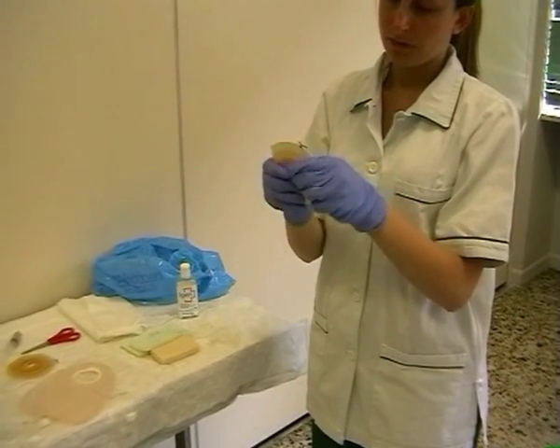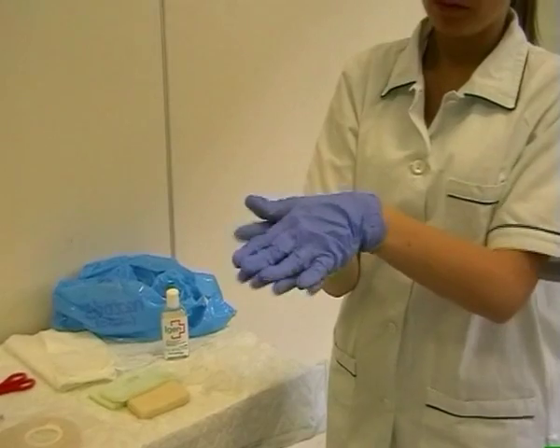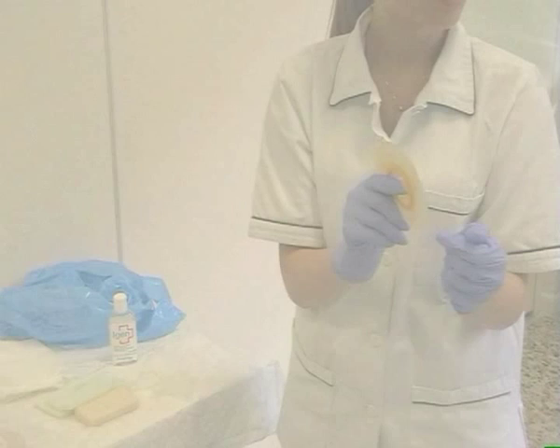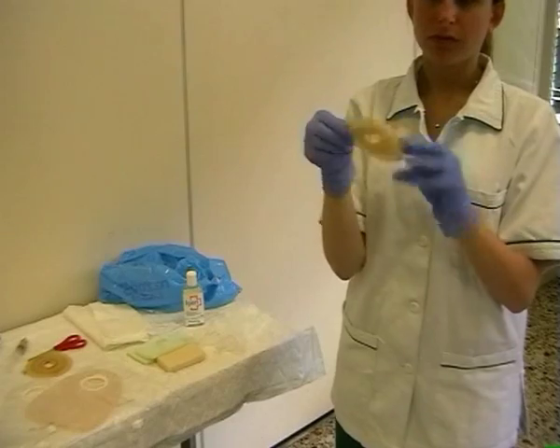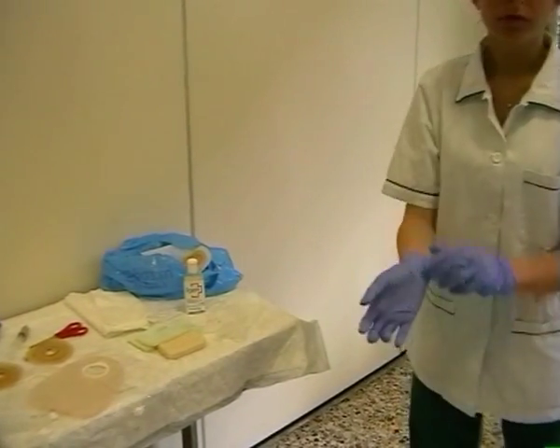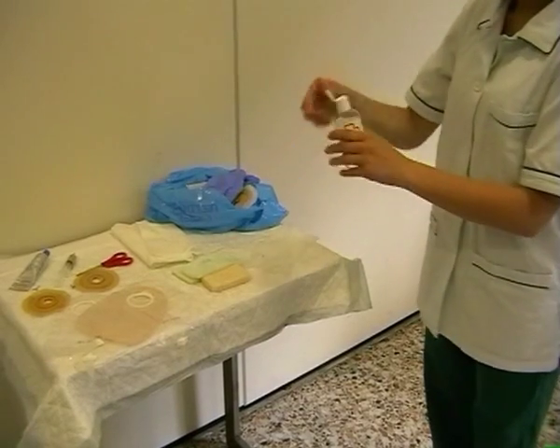Modellare bene tra le mani la placca e scaldarla tra le mani. Ricordarsi di togliere l'adesivo dalla placca, attaccare la placca al sacchetto, e gettare tutti i rifiuti nel sacchetto smaltibile con gli urbani.